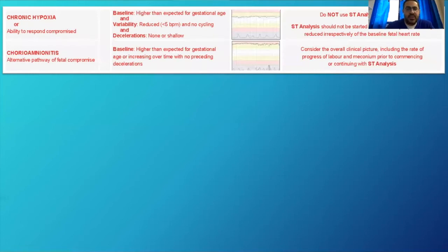Once again, we should not be pushing this baby further. We should have a clear conversation with the mom saying, well, your baby seems to be developing an infection. Babies don't do very well with infection, etc., etc. And that this is actually a different pathway from the hypoxia. That's a different pathway from the monitoring. We actually need to deliver this baby sooner rather than later to be able to give the baby the treatment that it requires, which is the antibiotics.